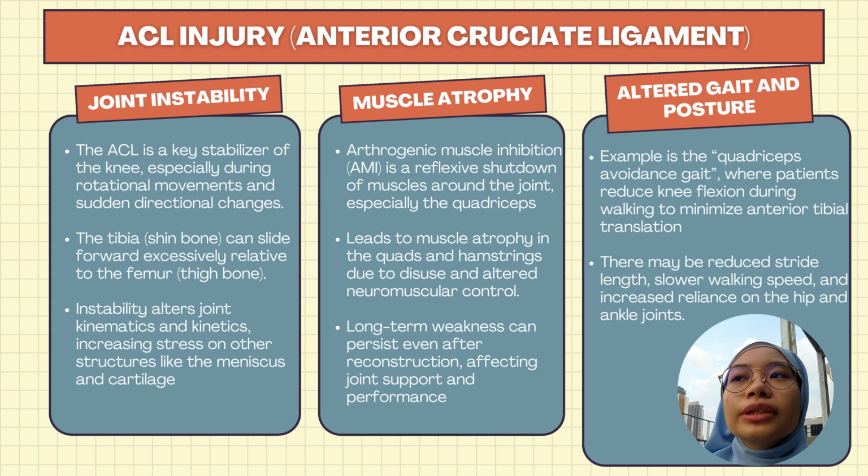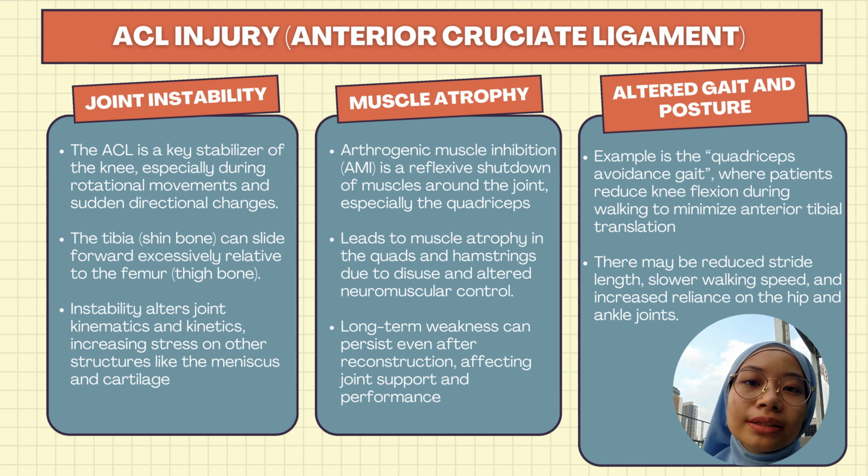So in other words, when a patient is experiencing pain on one knee, they tend to shift their body weight, and that causes pressure on the other leg. When this is done again and again over time, the adaptations can lead to postural imbalance, asymmetrical loading, and even back or hip discomfort for the patient.